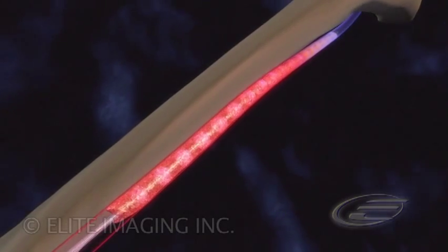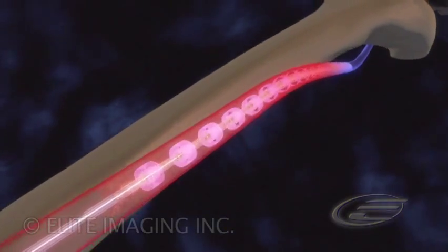The clot quickly clears, allowing the clinician to diagnose and treat any underlying lesion.